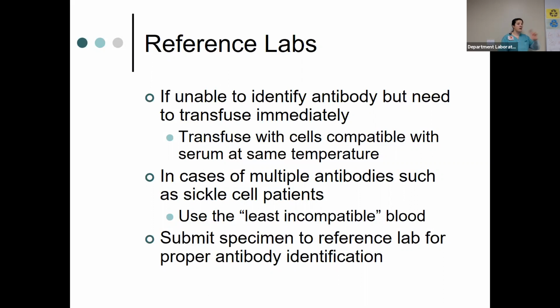And so they would say, well, all of our reactions are negative. So number one, it could be a low incidence antibody to a low incidence antigen that's on our cells, but not on theirs. Or it could be something the patient's reacting to in the gel reagent. We've had that happen before too.